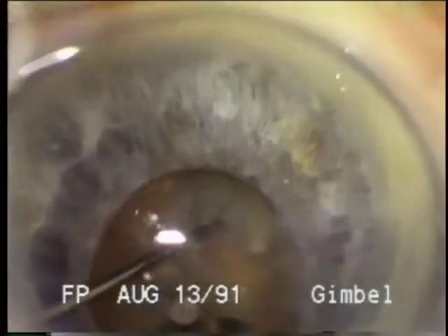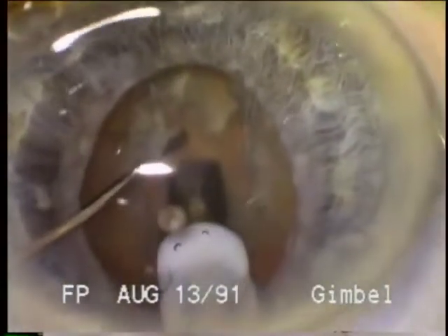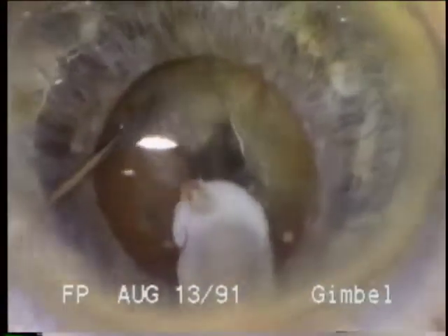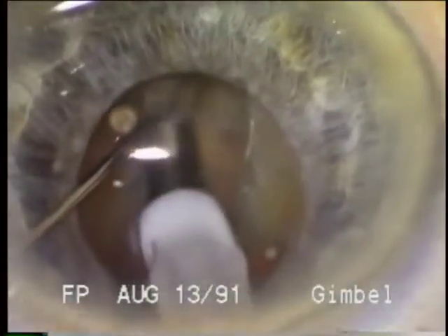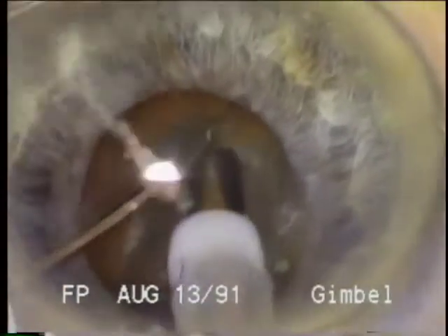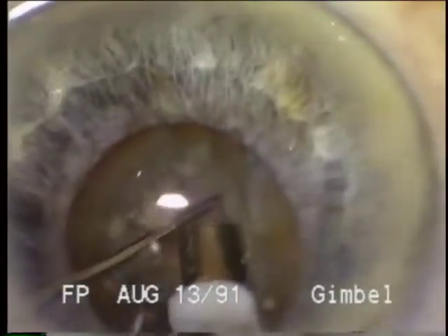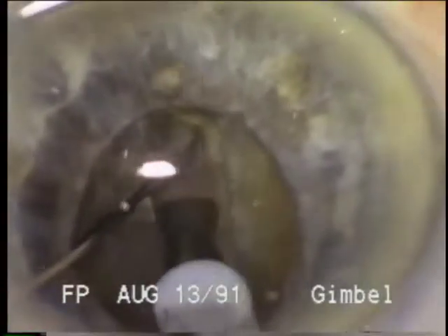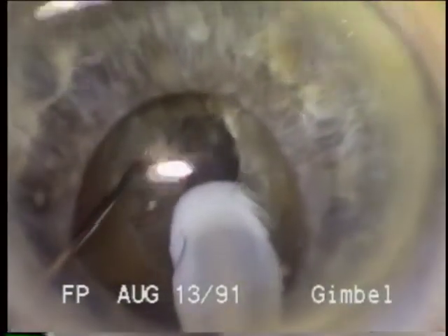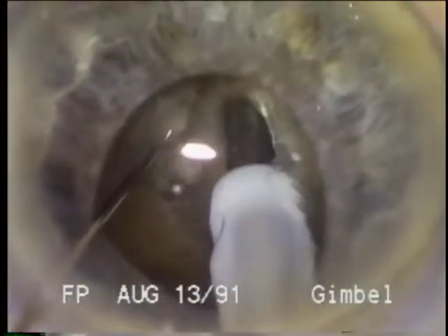Again, we see the spatula from the left nudging the nucleus inferiorly so that the sculpting can be done in the upper portion of the lens. We want to stay away from the edge of the pupil, and we want to get deep into the center of the lens early on in the technique. The goal here is to obtain a fracture through the posterior plate of the lens.